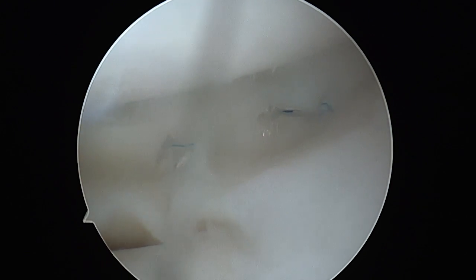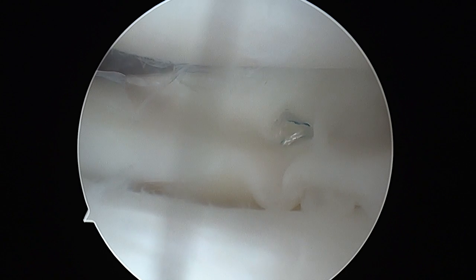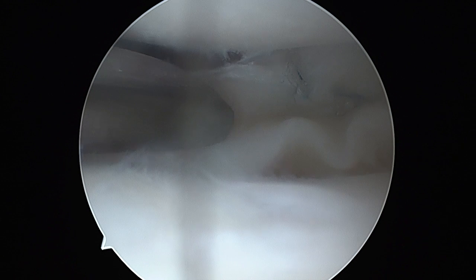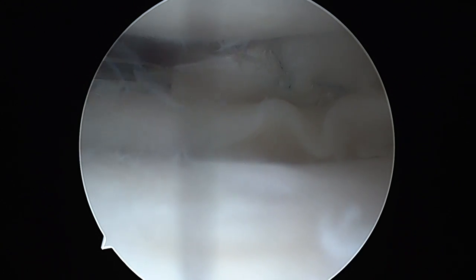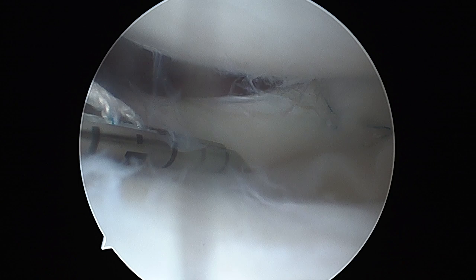We can now see that the meniscus looks rather stable, but we can't rely on only two anchors. A part of the posterior body is still rather unstable and needs to be fixed. We now apply our anchor to the posterior horn closer to the root, which is in a horizontal configuration.